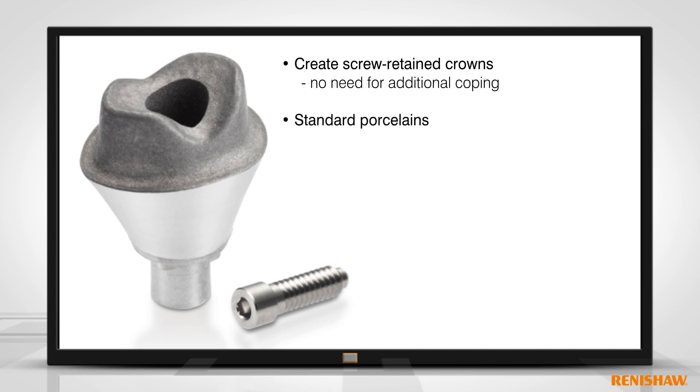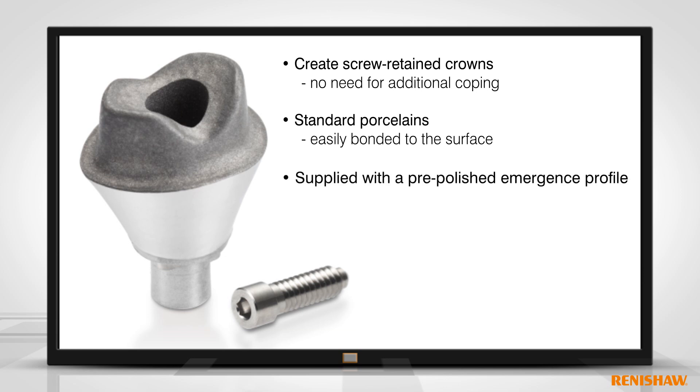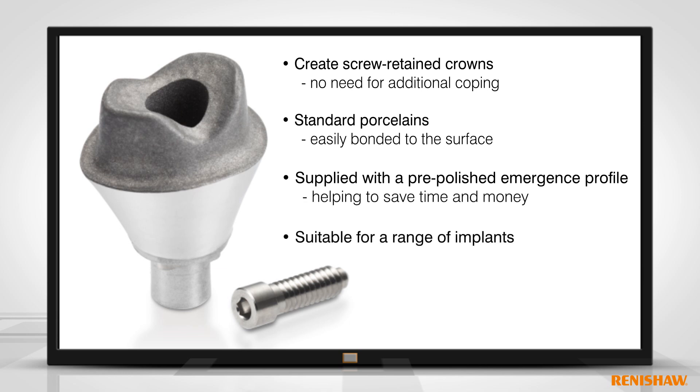The abutments take standard porcelains, which are easily bonded to the surface. The abutments are supplied with a pre-polished emergence profile, helping to save time and money. The abutments are suitable for a range of implant types.